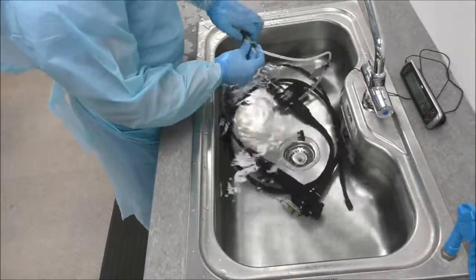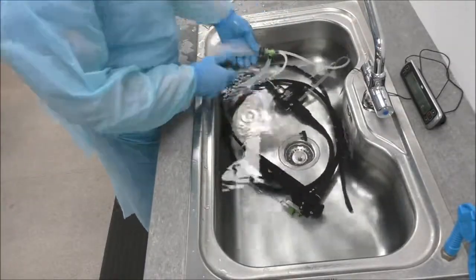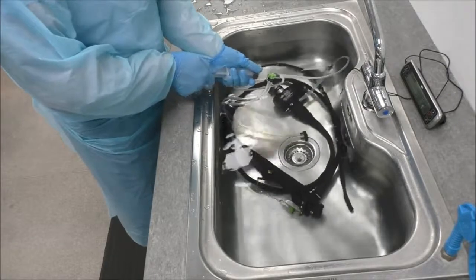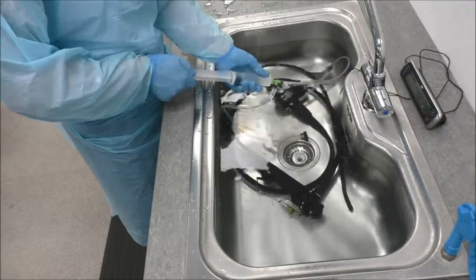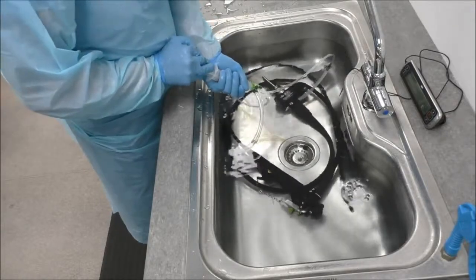Attach syringe to channel cleaning tubing. Draw detergent fluid into the syringe and flush the channels 3 times.